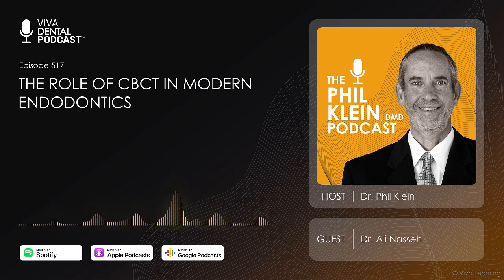I always say that the fate of your treatment is sealed at the moment of your decision-making, and that's treatment planning. Like, am I going to handle this case? How am I going to handle it? All of that treatment planning that goes into it is essentially based on your diagnosis and having the proper diagnosis. And if 3D imaging ahead of time will help improve your diagnosis, by proxy, it will help improve your success rate.